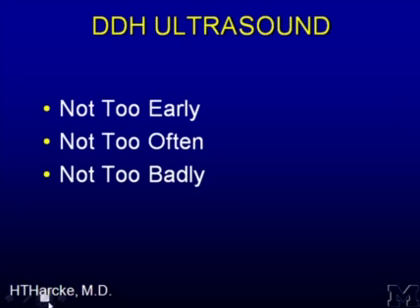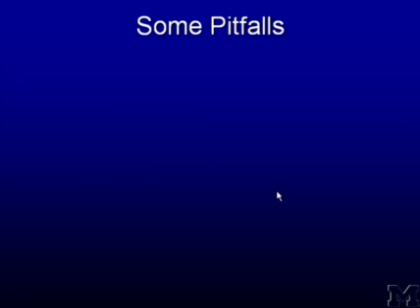And Dr. Harkey is one of the leaders and pioneers in this field, and he warns us about performing this study. It really takes a while to get some expertise and experience, but I'm hoping that this presentation will give you an overview and a chance to get started in this area. Now, a couple of common problems.